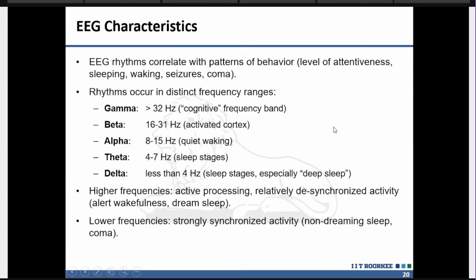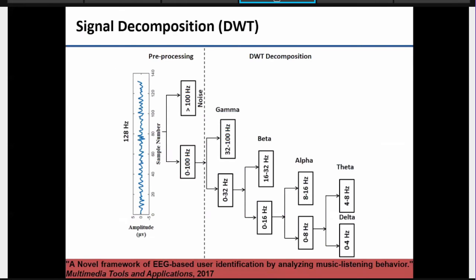I said that from those EEG signals, we can decompose them into different frequency components according to different frequency ranges. If someone is in a deep sleep or relaxed state, the signals will show only low frequency components. If I'm active, then it will show high frequency components. So we can now use this machine learning paradigm to solve these objectives, like what kind of disease it is or what the severity is.